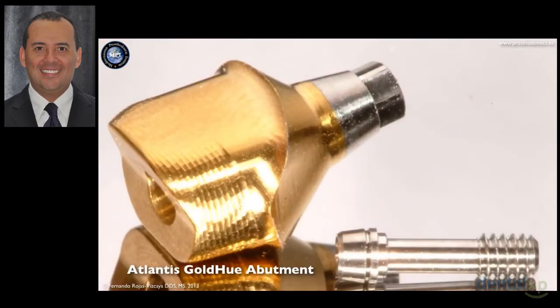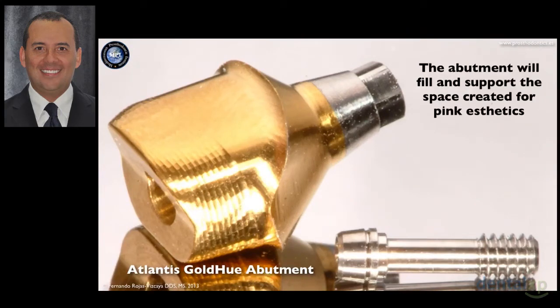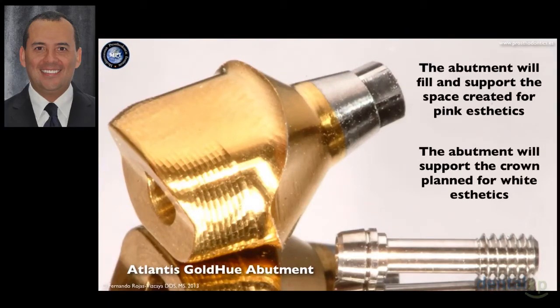And now using this CAD-CAM abutment, that is the Atlantis Gold Hue abutment, I will provide the support for the pink aesthetic that I create by placing the implant deep enough. And also this abutment will support the crown for the white aesthetic that I planned.